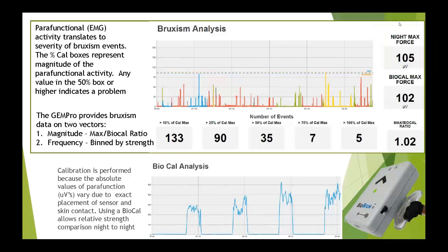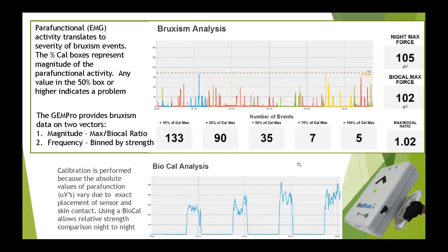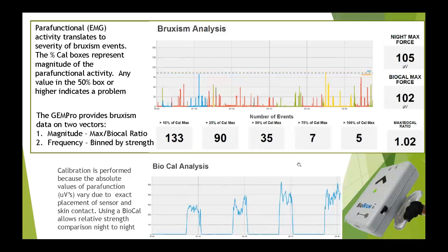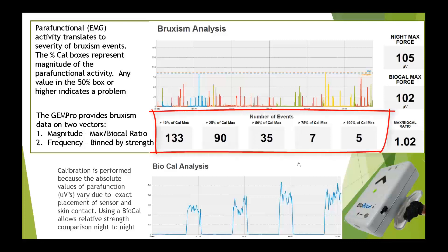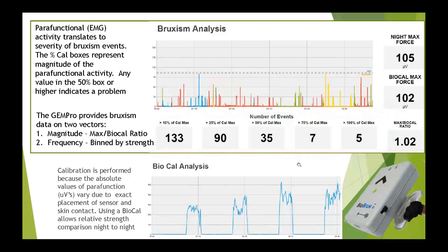With regards to magnitude or strength, the higher the spike on the graph the stronger the clench or grind. The study max force — the strongest measured while the patient was asleep — is 105 microvolts. So the night max force is 105, compared to the waking calibration of 102. This patient clenches or grinds about the same when asleep as when awake, giving a magnitude ratio of about 1. Anything above 1 you can point out to your patient, saying: 'Remember when you did that bite? You're actually clenching or grinding at about that same strength during the night.'